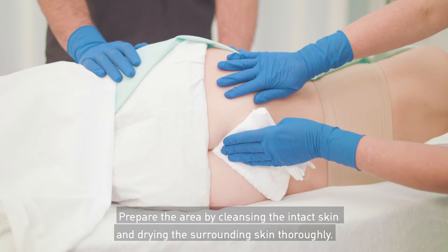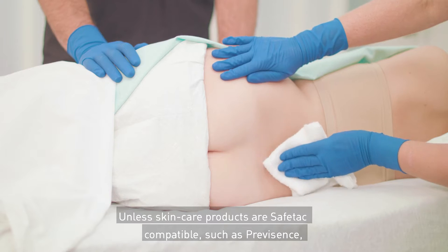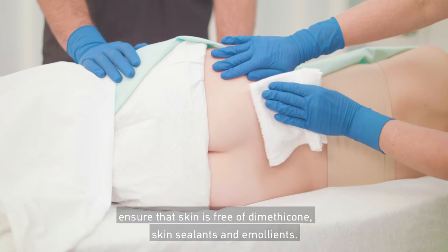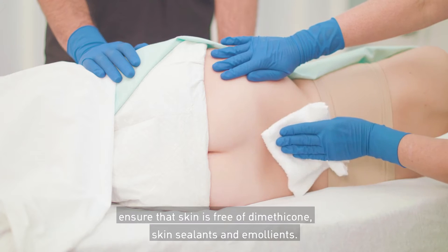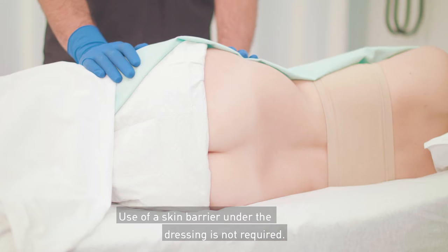Prepare the area by cleansing the intact skin and drying the surrounding skin thoroughly. Unless skin care products are SafeTac compatible, such as Prevacense, ensure that skin is free of dimethicone, skin sealants, and emollients. Use of a skin barrier under the dressing is not required.